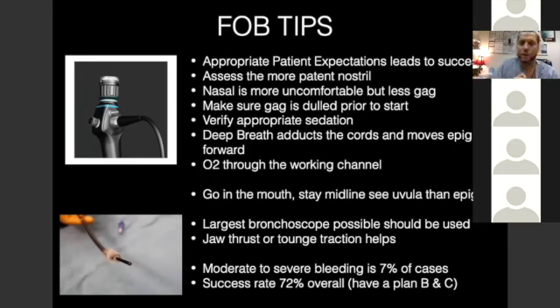Largest bronchoscope possible should be used. If you have someone pull the jaw forward, it'll help you get more space back there, and you'll see a little bit. Moderate to severe bleeding occurs in almost 1 in 10 patients, so be ready for that. And overall, in the literature, the success rate is 72%.